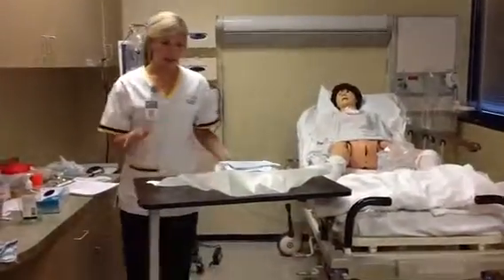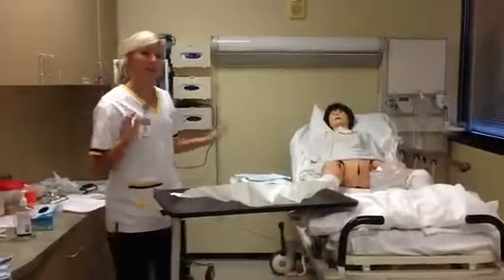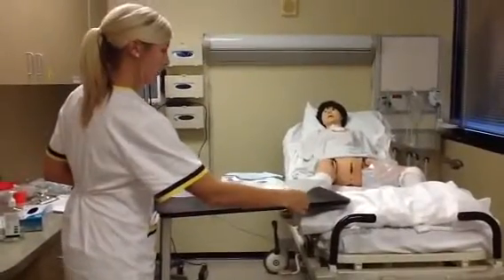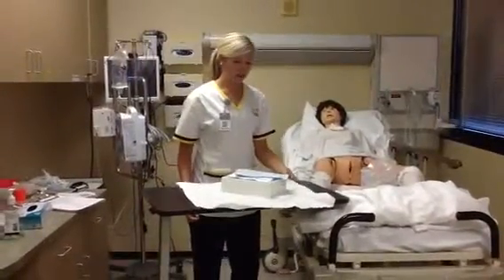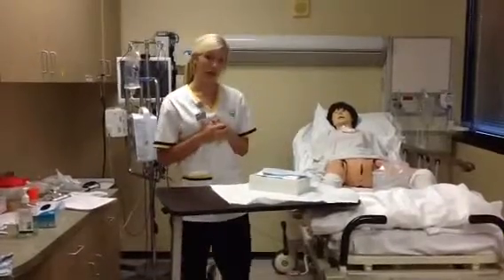To make sure that these edges aren't everywhere, I always want to keep my sterile field in sight and never turn my back to anything. So I'm going to reach around here, 1-inch margins, and make sure that this is correct and that it's not hanging over the edge at all.